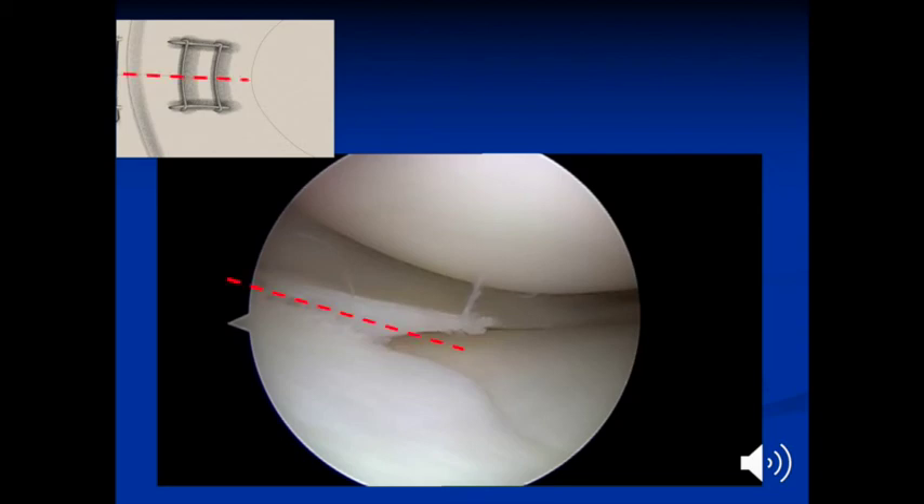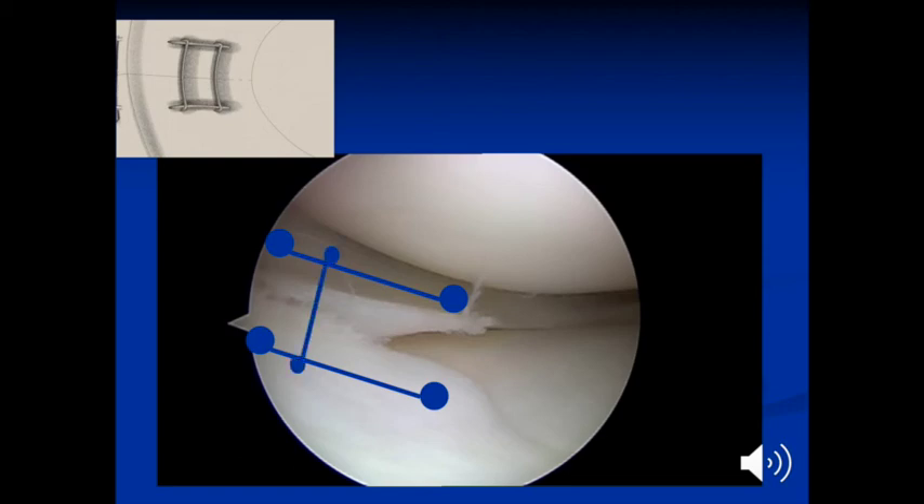The dotted red line demonstrates the orientation of the tear. The repair consists of four sutures placed first in a longitudinal fashion, posterior and anterior to the tear. These two sutures will act as the reinforcing sutures, and then two parallel horizontal mattress configuration type sutures.